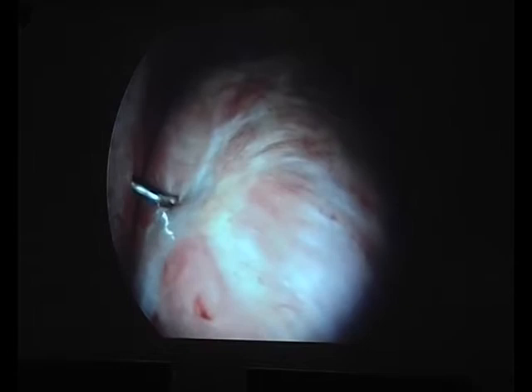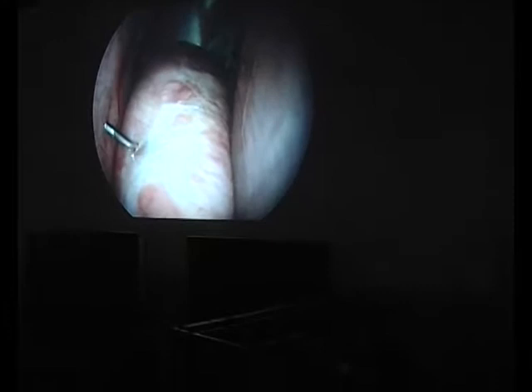So we bring in the toggle into the lumen of the abomasum, and now we can completely release the gas, and the abomasum slowly will sink down. It's very helpful if we have a rumen contraction for the emptying. And if we have a very slow emptying, we can take our optical system between rumen and abomasum and help it a little bit. Now it sinks down.